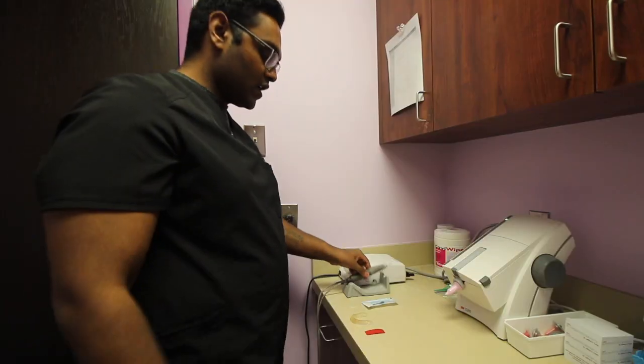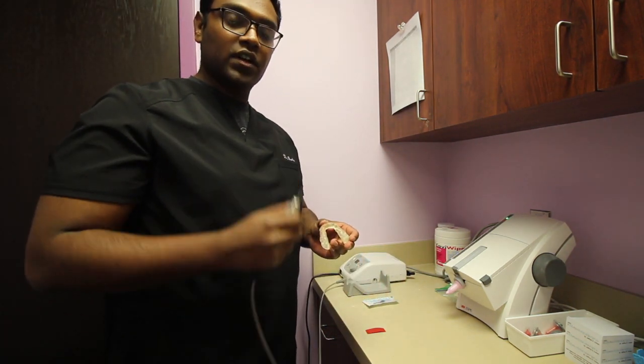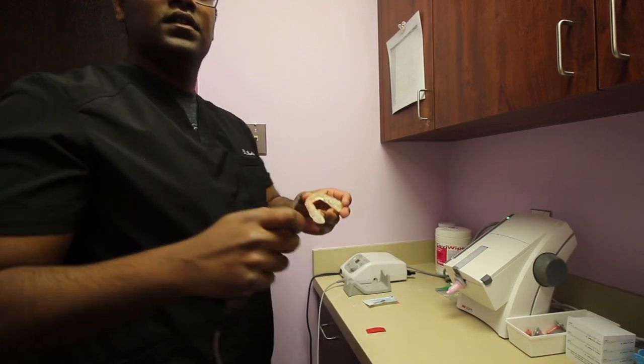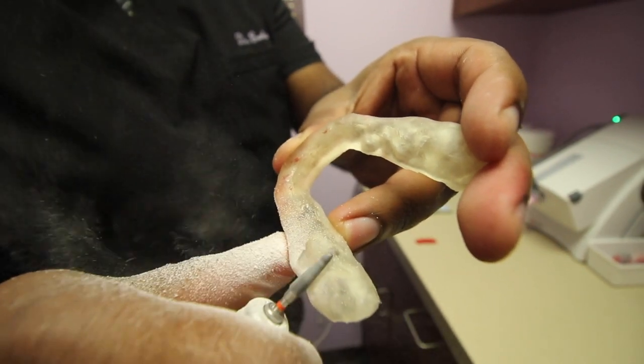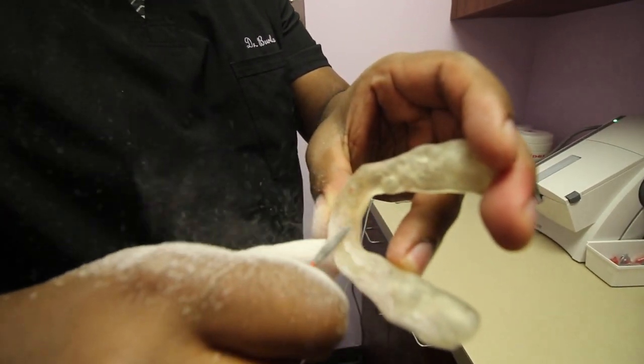So you put it back in the mouth. So if you notice, we have just marks on one side, and it's pretty thick. So we're going to go ahead and remove those marks. And then once we made the adjustment, we're going to try it one more time and get more marks, and then we're going to keep doing it until it's good.